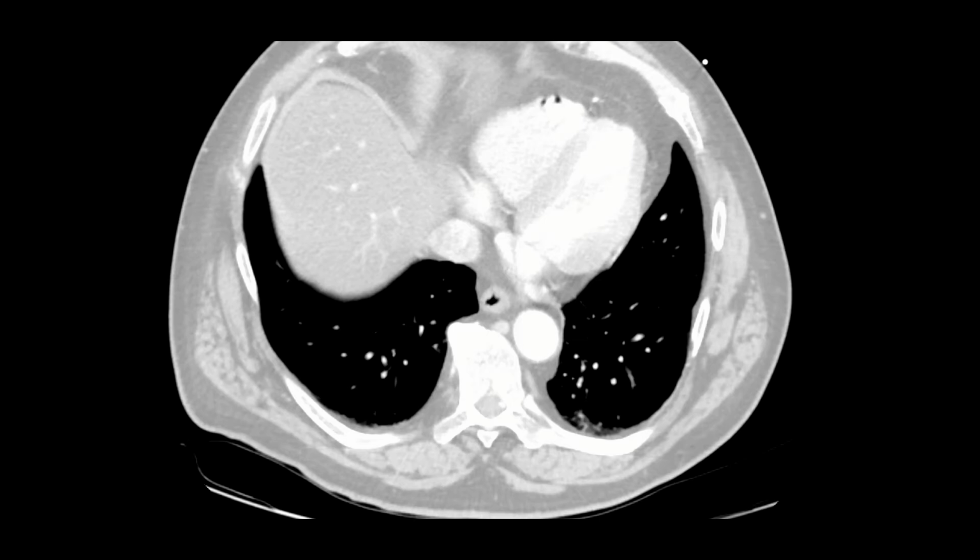Techs should always be checking their work. I don't expect you to make a diagnosis on a chest CT, but you should be looking to make sure you covered the anatomy correctly or covered all the pathology. If there's a mass in the right lung apex and it goes into the lower neck, my techs already know ahead of time they have to go back and cheat a little bit going up into the neck to give me those extra images. So we don't have to bring the patient back for a whole other CT with a second bolus of contrast and a whole second dose of radiation. Just go back and give me a couple extra images and I can make a better read on that chest CT.